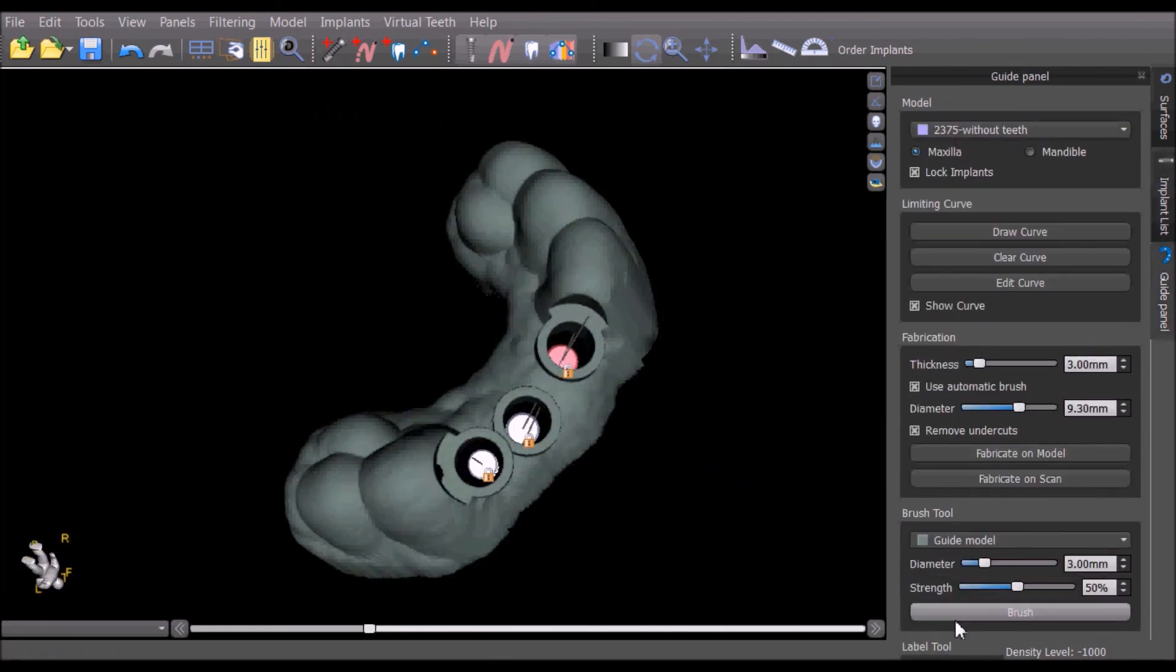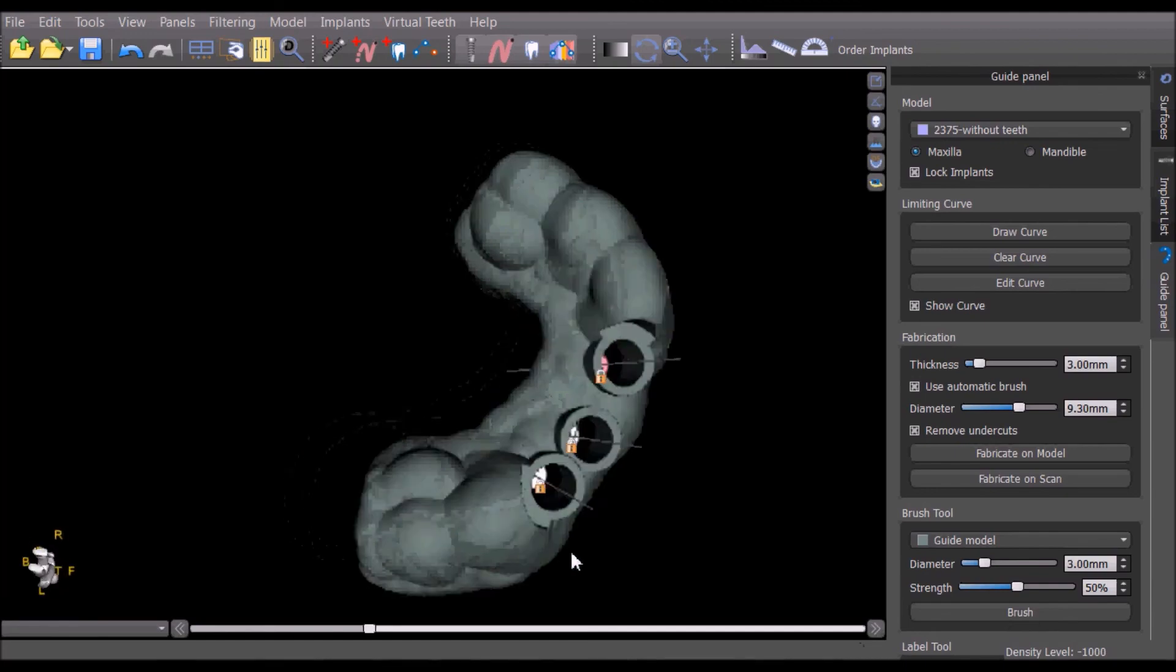The brush tool and the label tool can be used to make any final modifications to the surgical template.